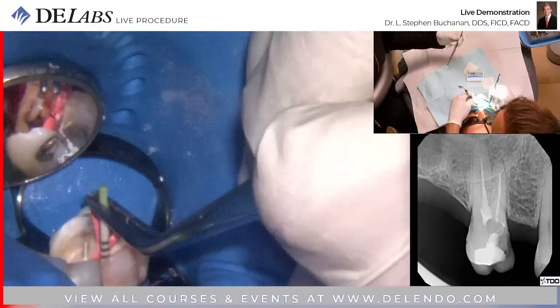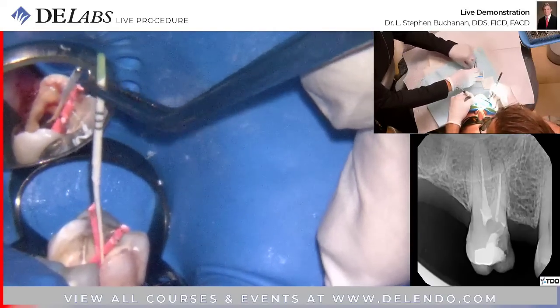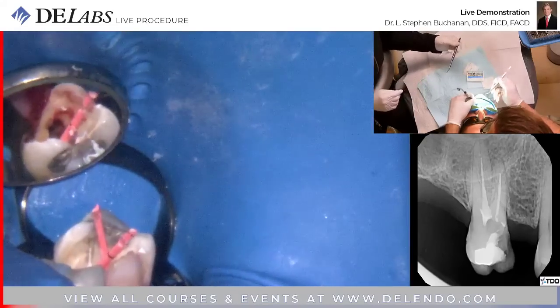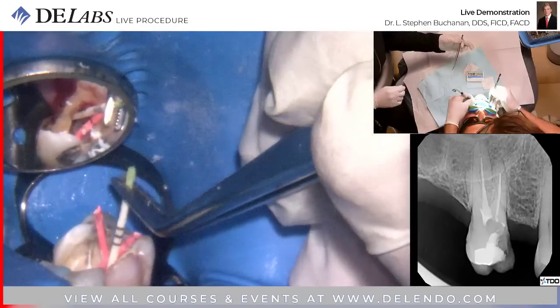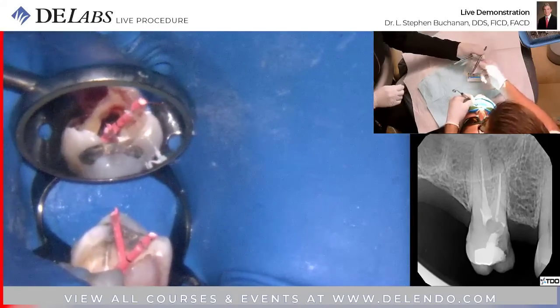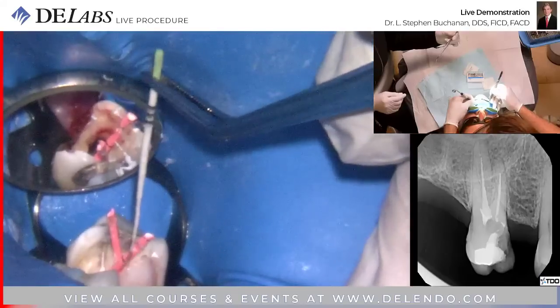That pumping that you did, is that what tends to fill the lateral canals? I want to make sure I get sealer down there. Usually it's not an issue with this sealer, but occasionally I don't have as much as I'd like. Also, I prefer a little puff that proves that I got to the end of the root canal. Here's my MB2. Yeah, I'm definitely going to have to put a cone in that thing. The MB3 I'm just going to expect to get filled from the reverse end up.